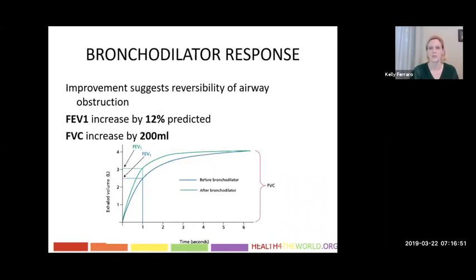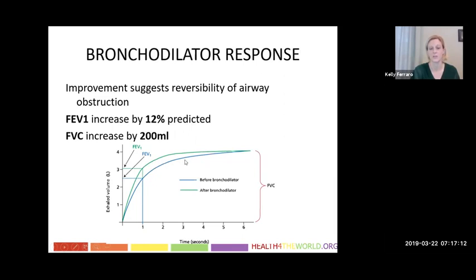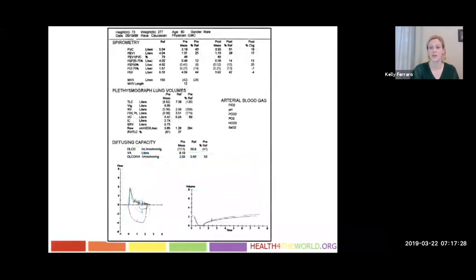When we see obstruction, we also want to ask: is there a bronchodilator response — reversibility of airway obstruction? The FEV1 would increase by 12% of predicted or 200 cc increase in FVC. This is the flow loop before the bronchodilator, and this is after — it increases by greater than 200 cc and greater than 12%. That's a positive bronchodilator response.